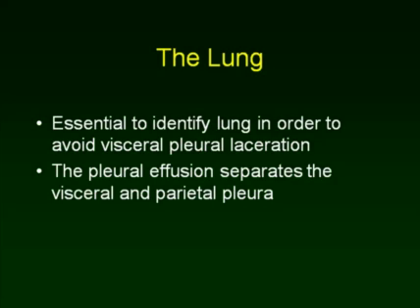If a major reason to use ultrasonography is not only to identify the effusion, but to seek a safe site for thoracentesis, obviously, it's essential to identify the lung in order to avoid visceral pleural laceration. The pleural effusion, of course, separates the visceral from the parietal pleura.